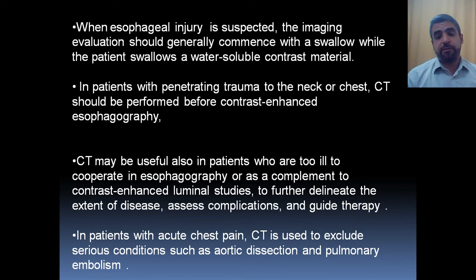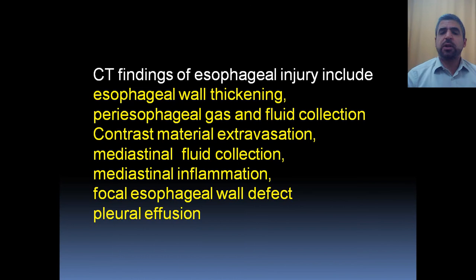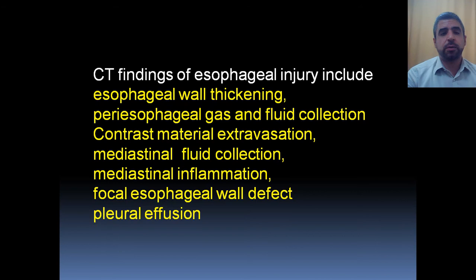The CT findings of esophageal injury include esophageal wall thickening, peri-esophageal gas and fluid collection, contrast material extravasation, mediastinal fluid collection, mediastinal inflammation, focal esophageal wall defect, and pleural effusion. These are the main findings in esophageal injury.